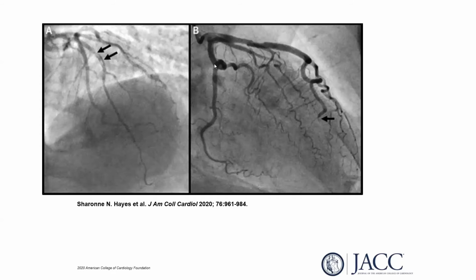B is another case. It's a total occlusion in a patient with heavy tortuosity. You know, could it be SCAD? Could it be atherosclerotic? In this particular case, it's easier, like I said, when it's total occlusion, I would just wire it. You have to open it. There is an ongoing ischemia, and look for the features after wiring.